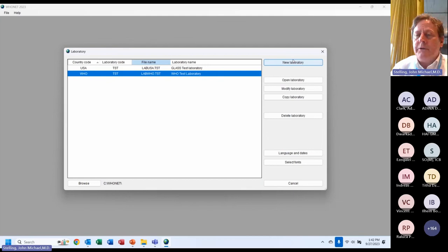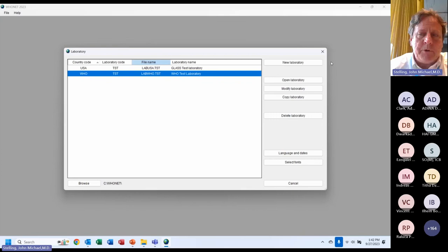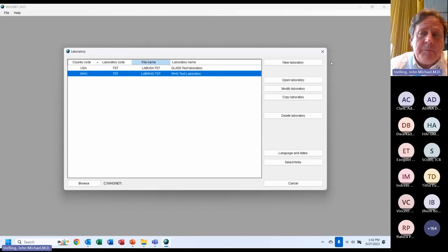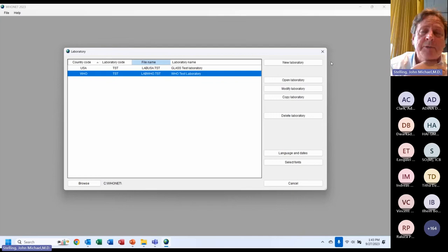WHO Net gives you a standard list of human and/or animal, food, and environmental questions, and you can add or remove from the list — this is what we call configuration. You can open the lab for data entry and analysis, modify it to add or remove antibiotics, create one laboratory and make multiple copies, or delete it. Under Languages and Dates, you can change the interface language — Vietnamese, Russian, and many others. Most translations were done with Google Translate, which is good but not perfect, and we are happy to work with you to improve them.